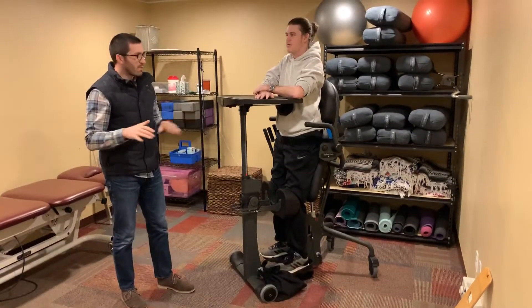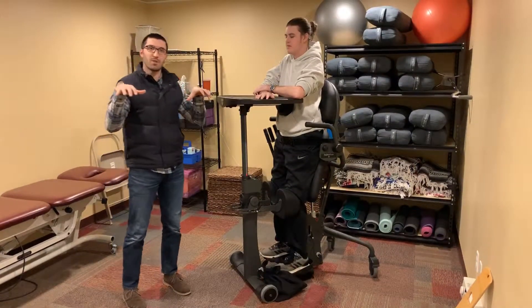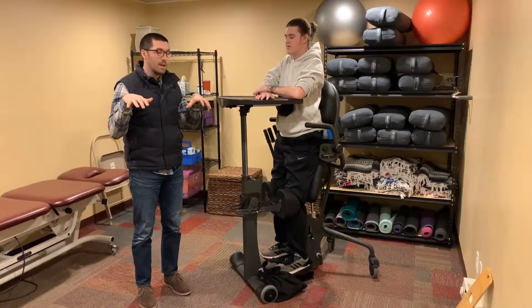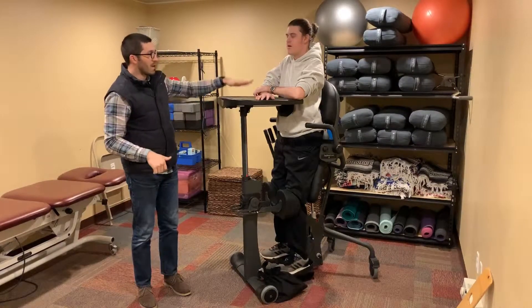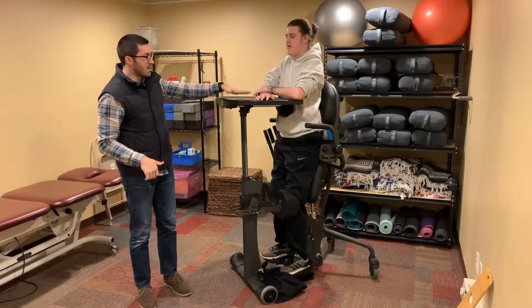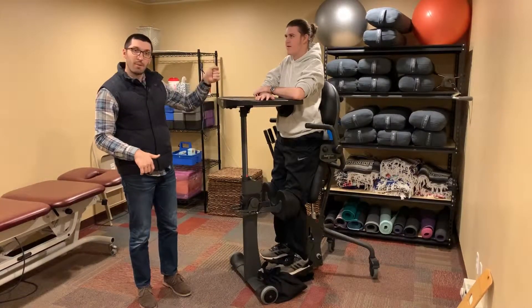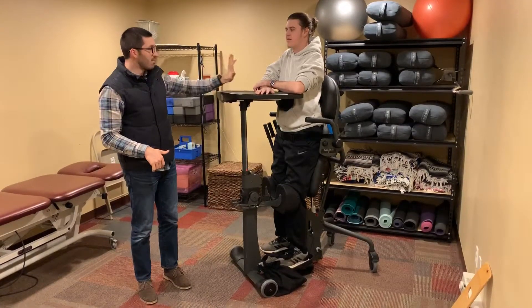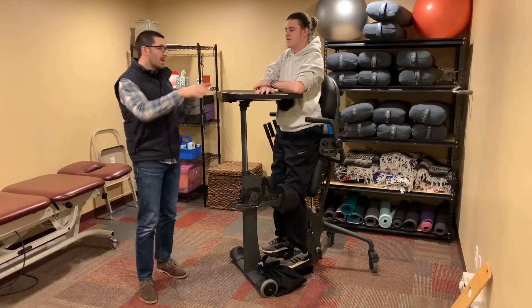When we felt like everything was good, I had one person supporting his shoulders to keep him upright behind him, and then we pumped ourselves up into this position, maneuvered the table portion up to the appropriate height, and moved it in towards Trev as well.